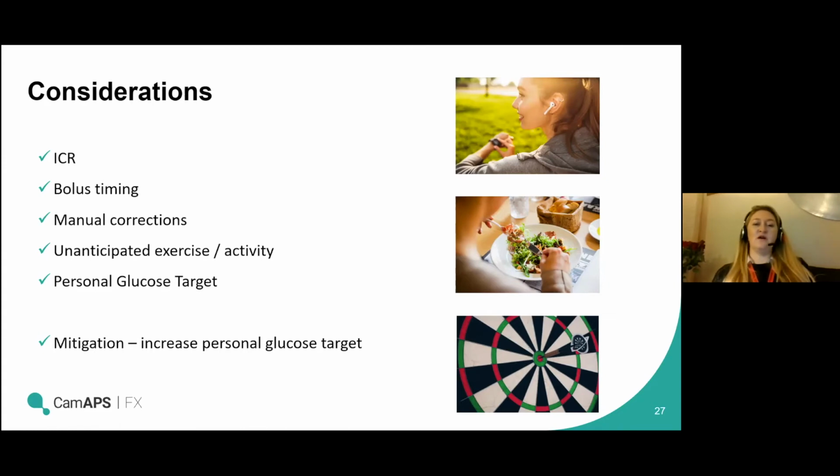So if you know you've got a gym class or something at a particular time of day, in the morning at breakfast, when you might be thinking about how your day is going to go, you could preset Ease Off to come on an hour and a half before you know you're going to be doing that activity, and help stop some potential dips caused by it.